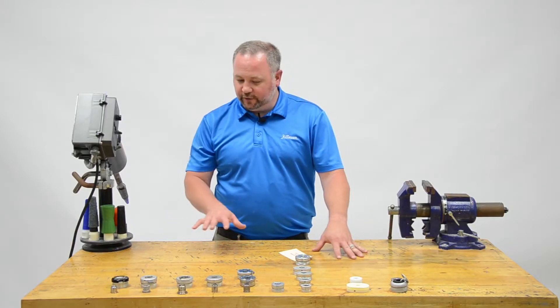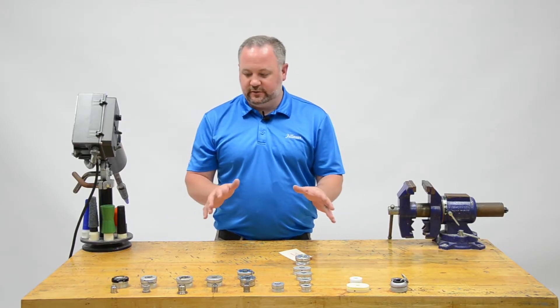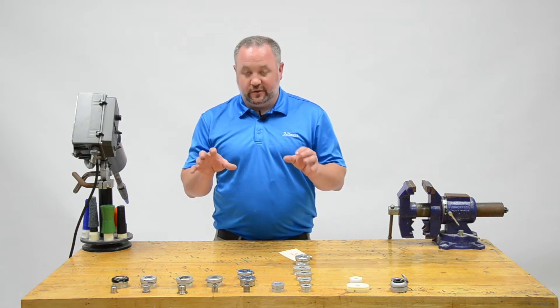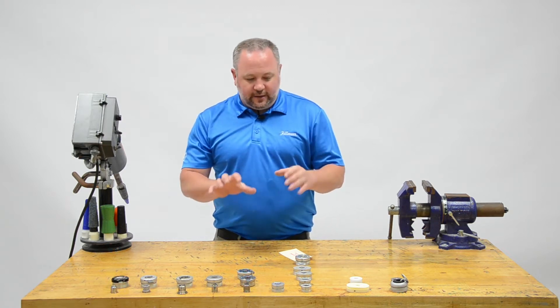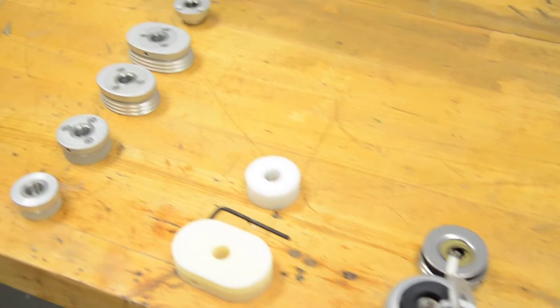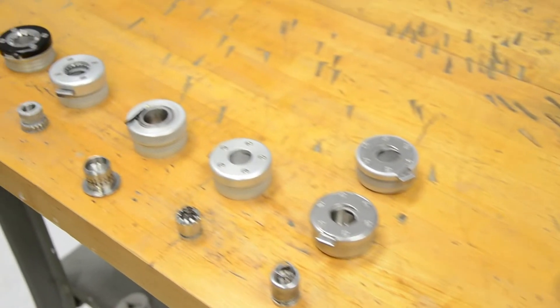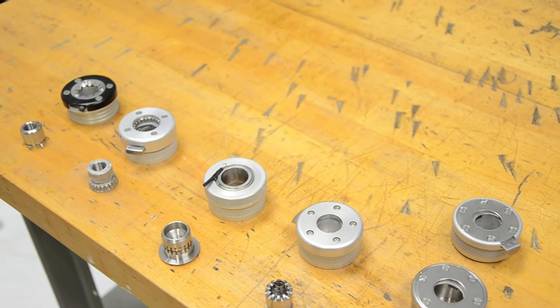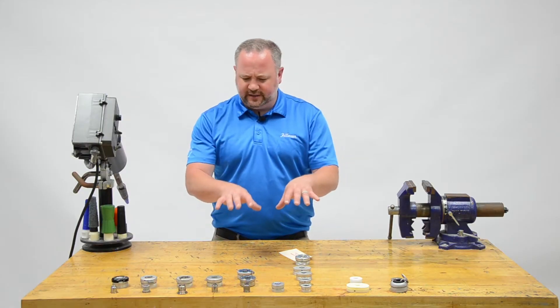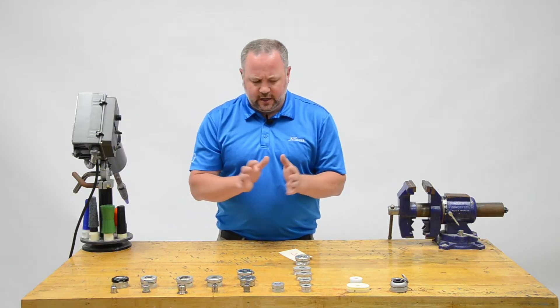When fitting upper extremity body-powered devices, one of the biggest challenges is choosing the right wrist for the job. There are a lot of options. I think at one point I counted 56 different options in wrists. Obviously this is not all the wrists we have, but this will give you a pretty good idea of what those options look like.